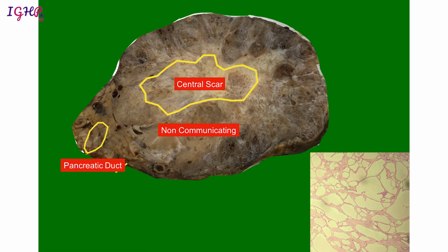Now this is a serous cystic neoplasm, and serous cystadenomas will have a large tumor. As already said, they will be occurring in elderly patients. At times they could have a central scar, as is beautifully seen here, and the cut surface will have a spongy appearance like that of lung tissue. There will be numerous small cysts, which are more beautifully highlighted on microscopy, wherein they will be lined by low cuboidal epithelium. Here you could make out that the normal pancreatic tissue is present at the periphery of the lesion. So this is a case of a serous cystadenoma, and it is just like a sponge. So it will have a spongy morphology.